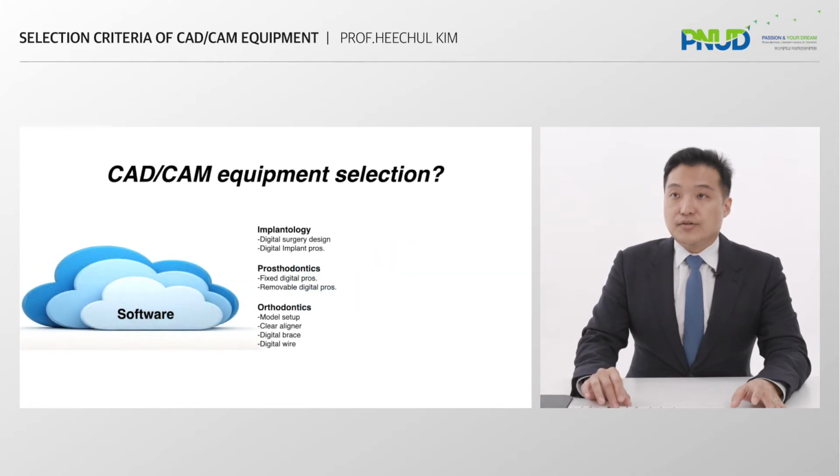The CAD software can be mainly divided into prosthetics, implants, and orthodontics. Once a virtual 3D prosthesis has been designed, you proceed on to the fabrication stage. As previously mentioned, this selection of CAD software is equivalent to the selection of digital treatment.